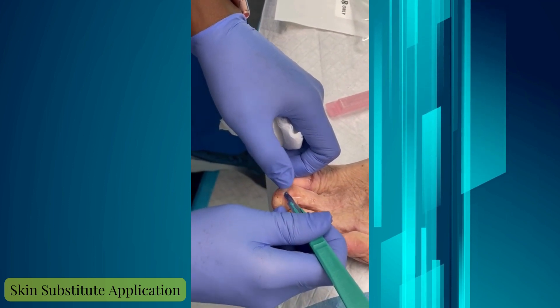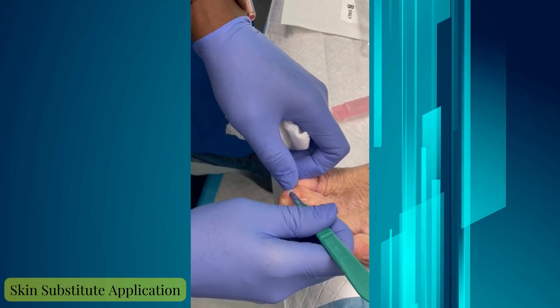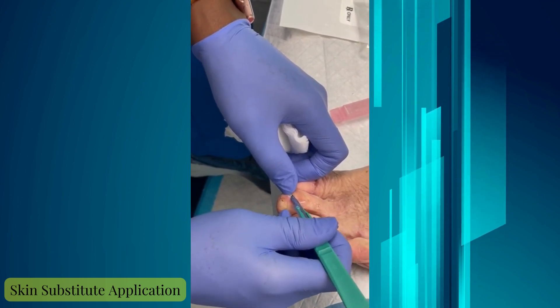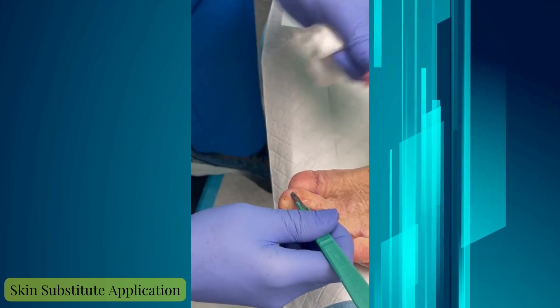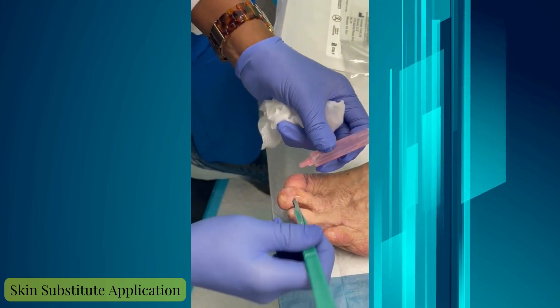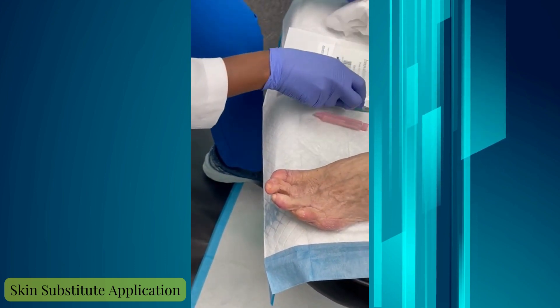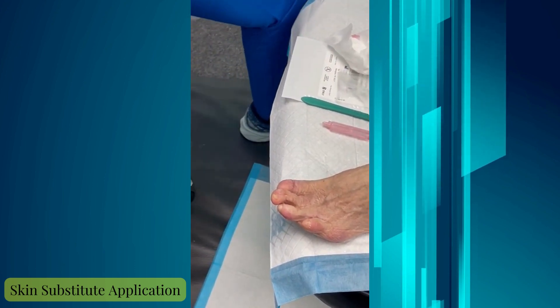Sometimes we'll couple this with an additional collagen, but since this is the first application, I like to see how the patient responds. This will stay on and in place for the next two weeks and become incorporated into the skin.